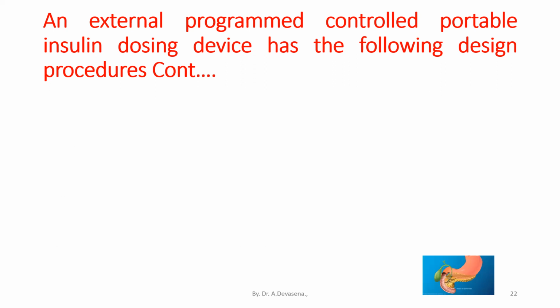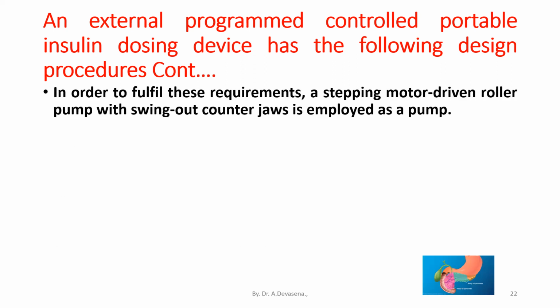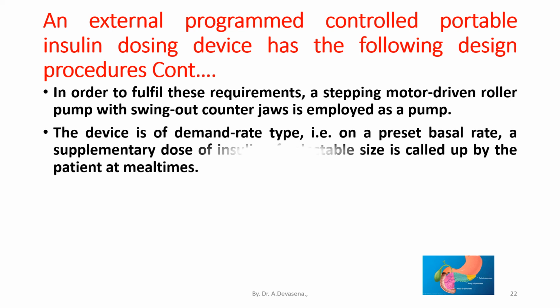In order to fulfill these requirements, a stepping motor-driven roller pump with swing-out counter jaws is employed as the pump. The device is of demand rate type, that is, on a preset basal rate, a supplementary dose of insulin of selectable size is called up by the patient at meal times.